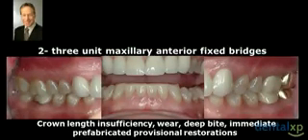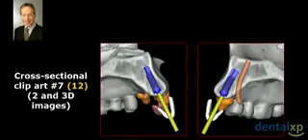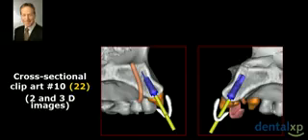Now the question is, can you actually enter a surgical prosthetic arena with the confidence that if you follow the plan accurately, you can develop a successful solution? So let me take this forward. Scanning appliance, development of the images. This is the other lateral incisor.